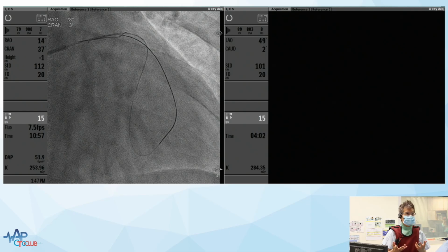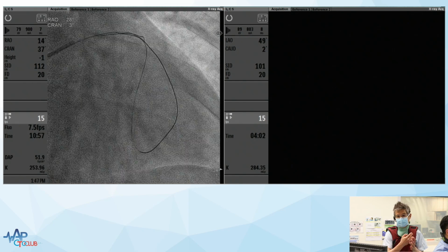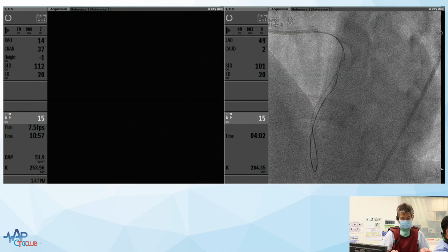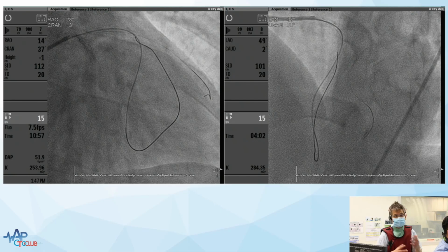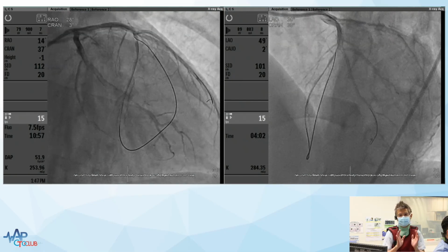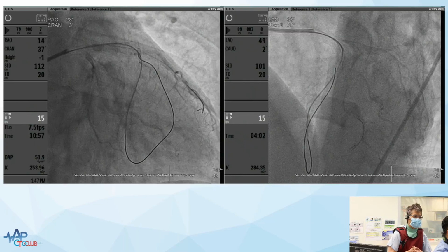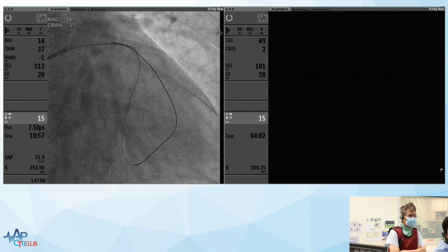Now, the other thing, of course, you can do is angiogram. A 2-view angiogram is actually quite reliable to see the retrograde position. If on a 2-view angiogram we can see the diagonal and the retrograde wire clearly, then I think we can try a tip in. If the tip in works, then we can convert to antegrade, and I think that will be the safest. I really don't want to push this retrograde channel. It's a very small septal, very easy to rupture. That's my point of view.